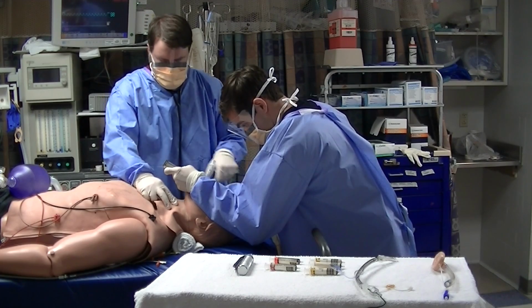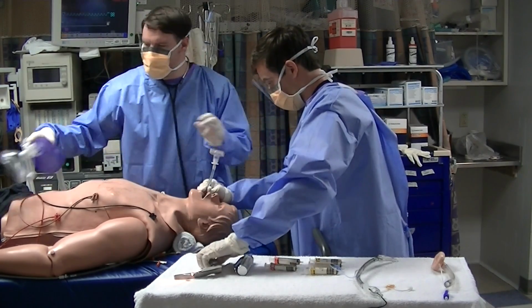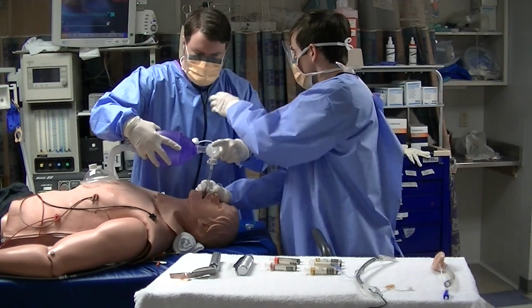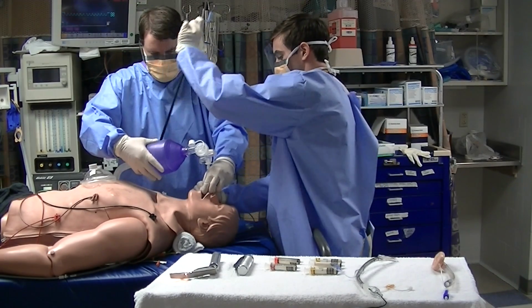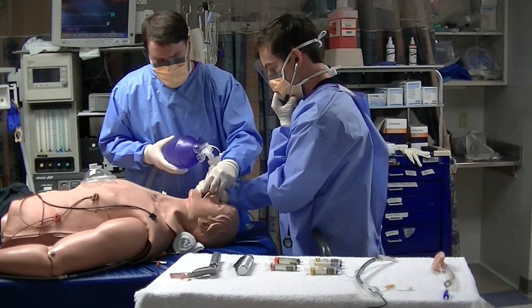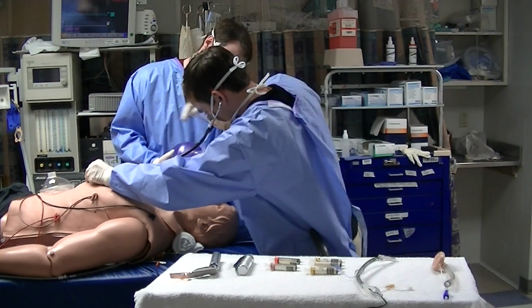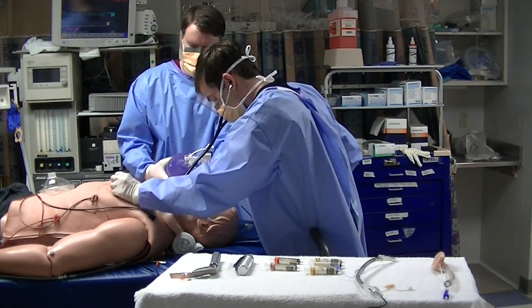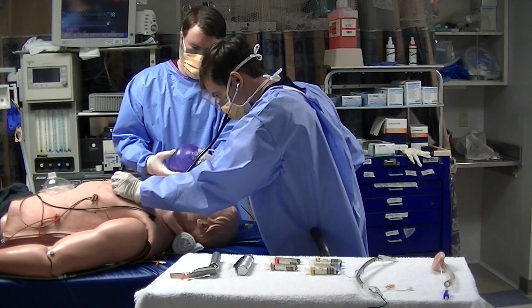Once the provider is satisfied with the ET tube placement, the stylet is then removed and the colorimetric end-tidal CO2 device is attached. The bag valve mask attaches to the end-tidal CO2 and a couple breaths are given to confirm placement in the respiratory tract. The provider then takes his stethoscope and auscultates over the stomach to ensure no breath sounds are heard there. He then places the stethoscope over both lungs to ensure that he hears bilateral breath sounds.